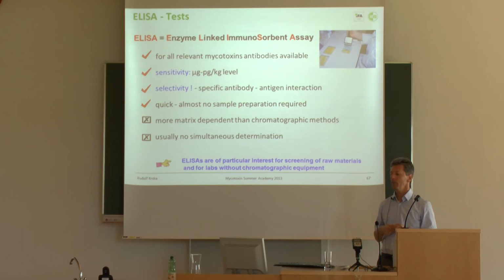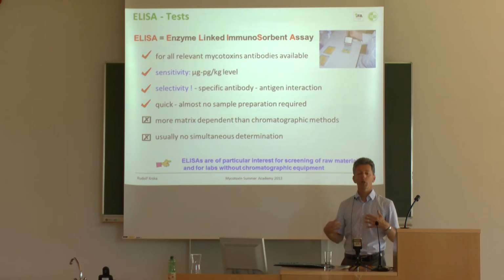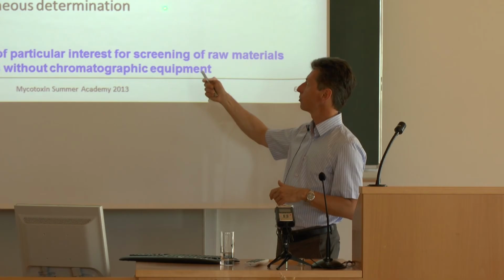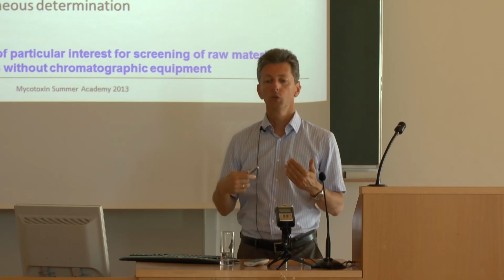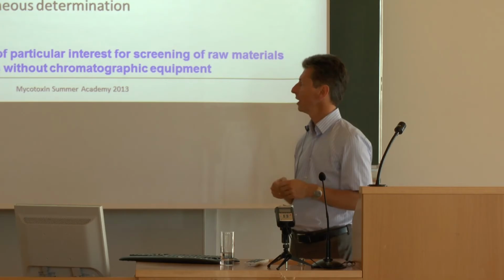relevant mycotoxins. There are antibodies available, highly sensitive, highly selective, obviously due to the specific antibody and antigen interactions. And well, as we are talking about rapid methods, it's a quick method. However, more matrix dependent than chromatographic methods. ELISAs are also not actually eligible to participate in the certification of a reference material because the results are still too inaccurate. And usually no simultaneous determination is actually carried out.